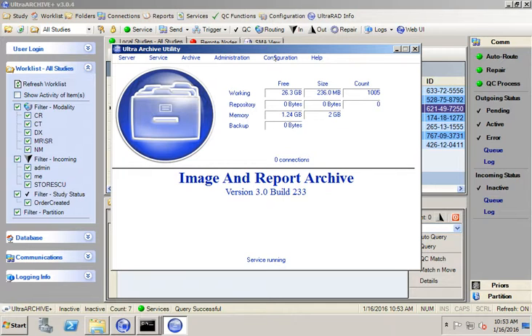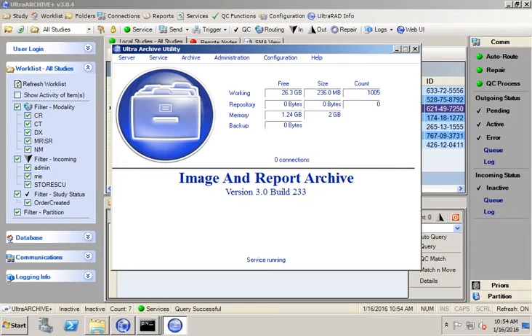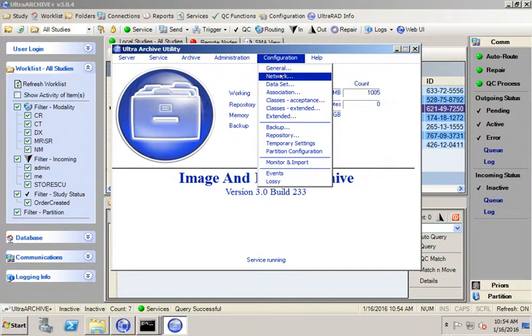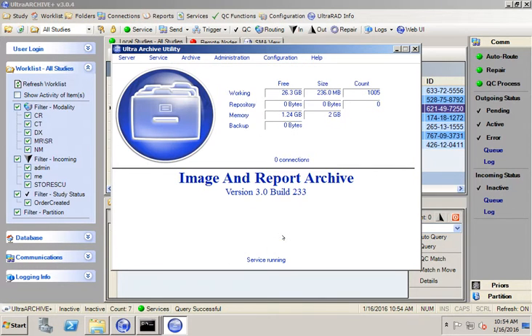With gateway ports, we have other logging mechanisms you could use, but the logging available in the Archive Plus is much more detailed. So I'm going to log in with a user account that has administrative rights to the software. I'm going to click on Configuration, Network. At the bottom, you'll see the debug options. I'm going to turn on all 4 debug options: commands, data, transfers, and errors. I'm going to click OK, and I'm going to click on Service.